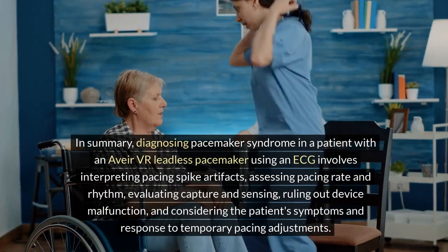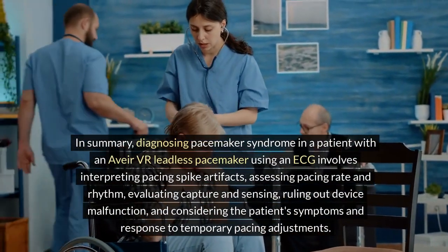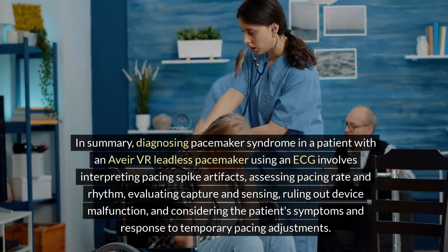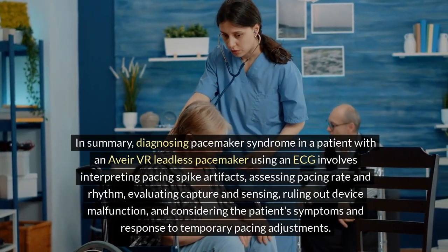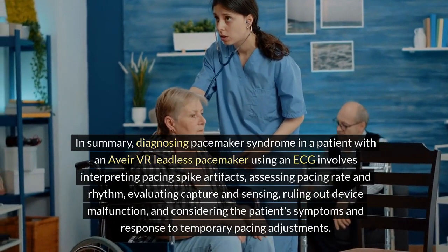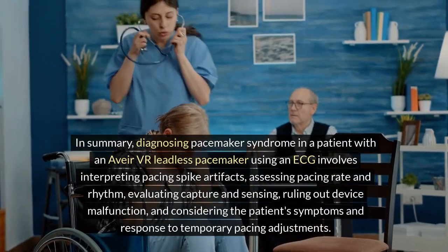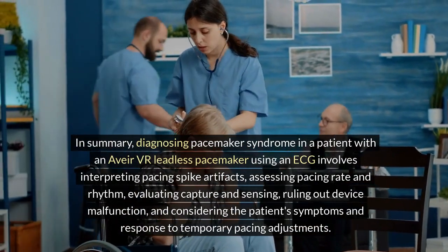In summary, diagnosing pacemaker syndrome in a patient with an Aveir VR leadless pacemaker using an ECG involves interpreting pacing spike artifacts, assessing pacing rate and rhythm, evaluating capture and sensing, ruling out device malfunction, and considering the patient's symptoms and response to temporary pacing adjustments.